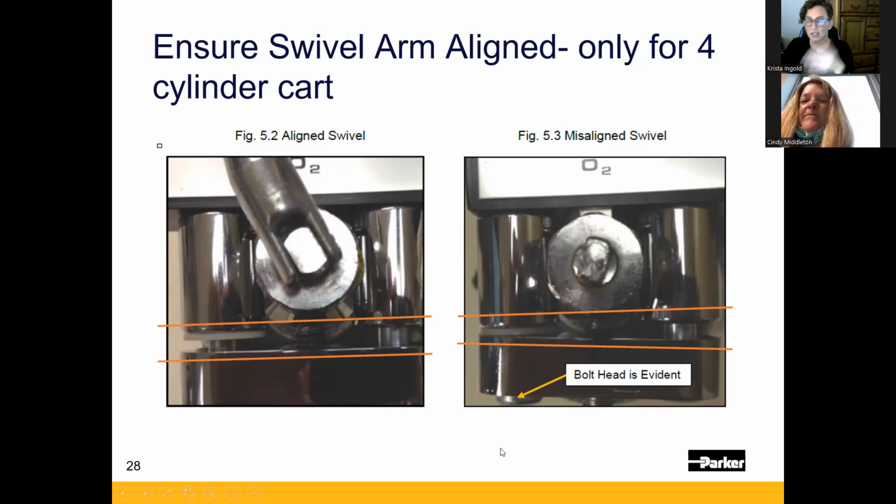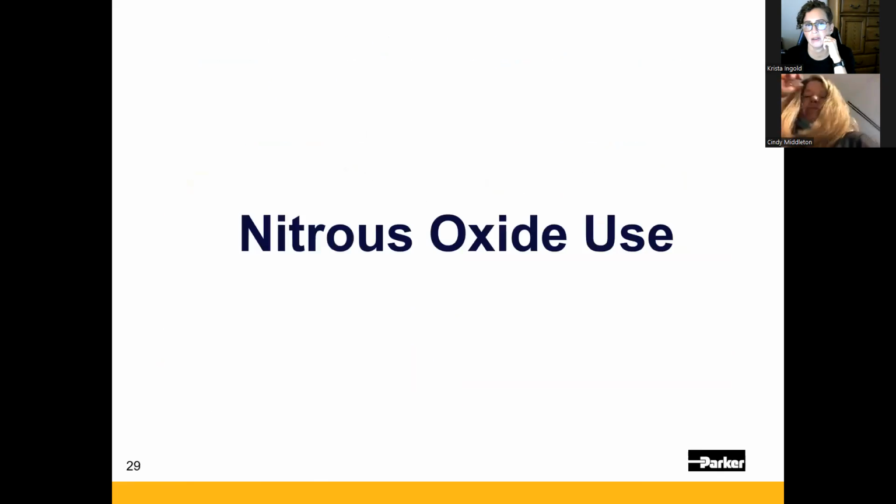If it still hisses, so when you're setting up, if you're getting any kind of hissing with this gas, or maybe when you change your cylinder, just immediately close it. And again, make sure your bar is straight and make sure you have a good washer, okay?